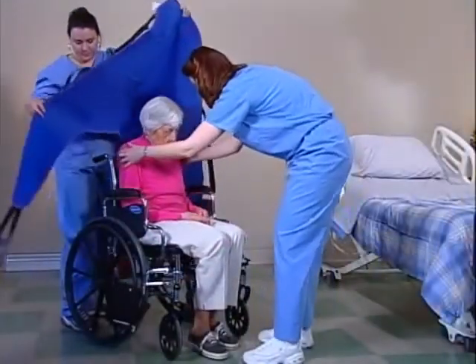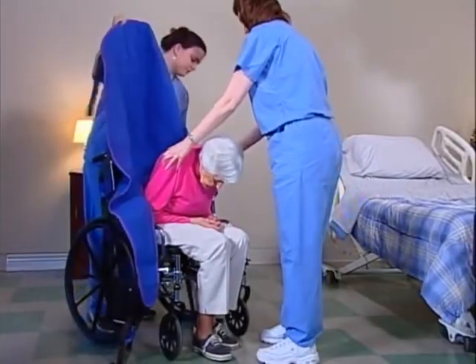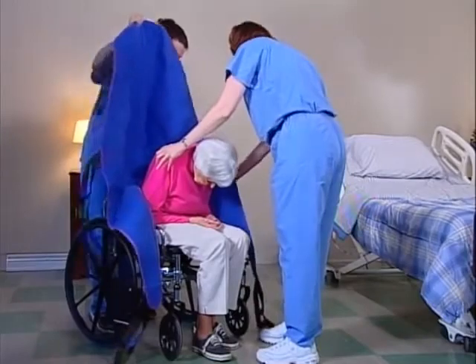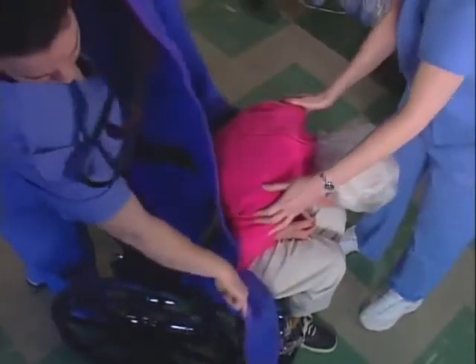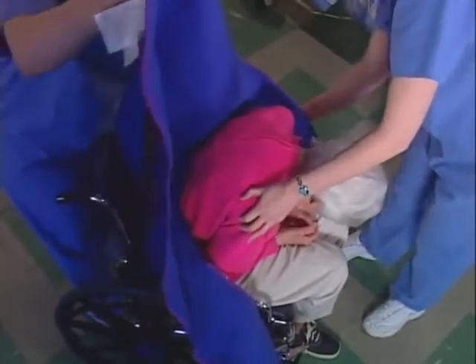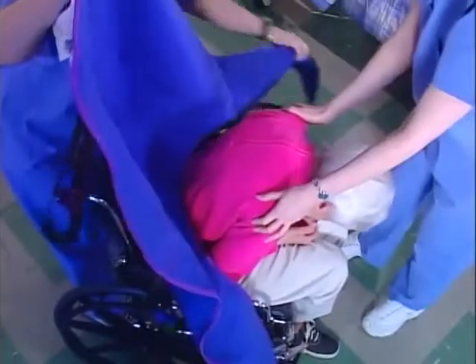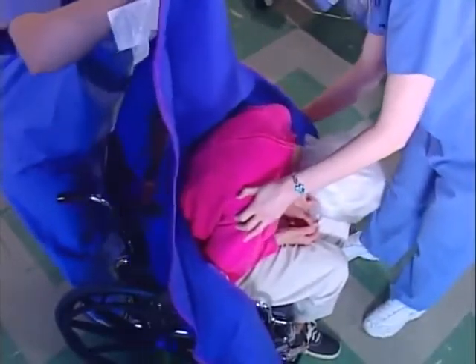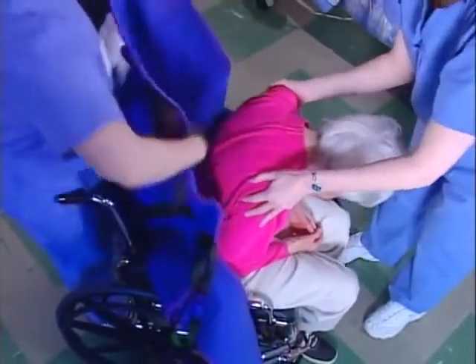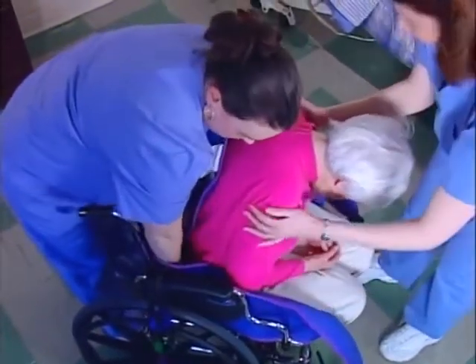Position the sling on the resident. One caregiver should stand in front of the wheelchair and the other should stand in back. Lean the resident forward in the chair, letting the caregiver in front support the resident's weight if needed. Slide the sling behind the resident with the smooth surface against the resident's body and the grab handles outside. The sling should be positioned between the top of the resident's head and the base of the spine.